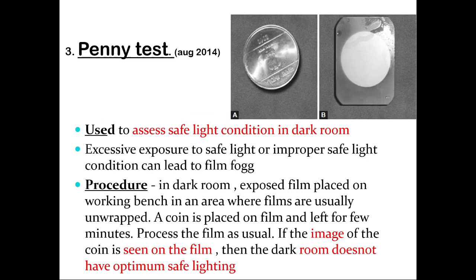Then the next question that can be asked is film processing. You can mention the manual processing, then the automatic processing technique, and then the daylight processing. Then the next question that can be asked for short notes is the penny coin test.